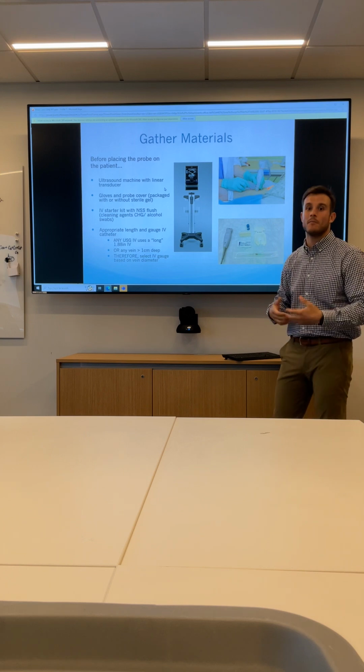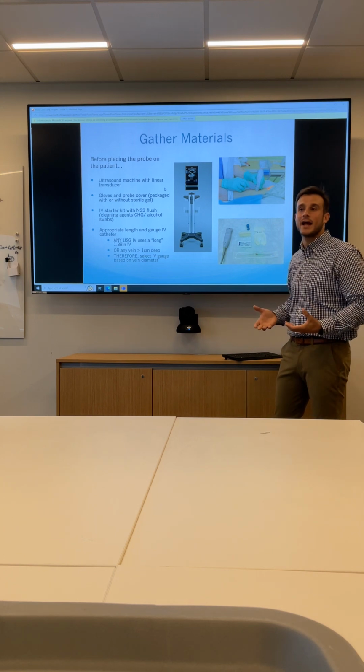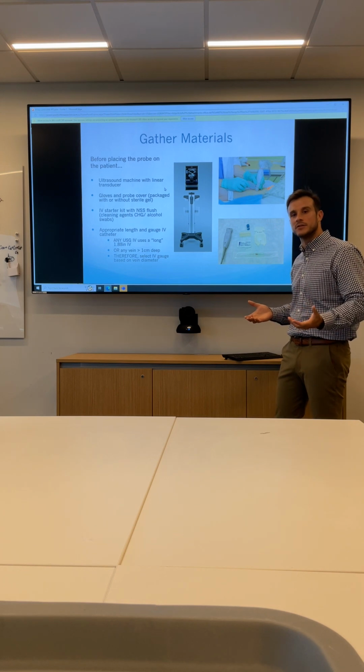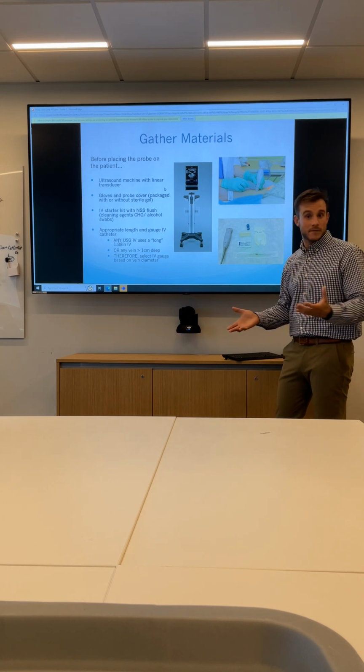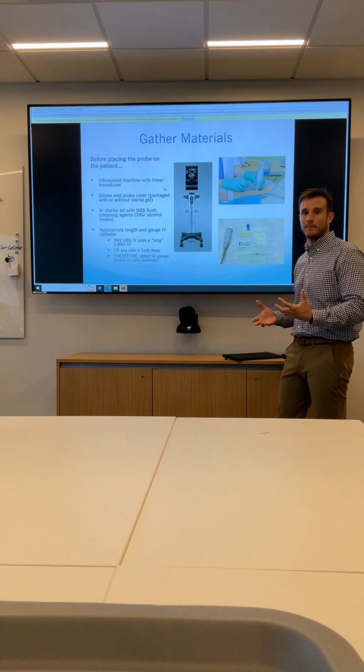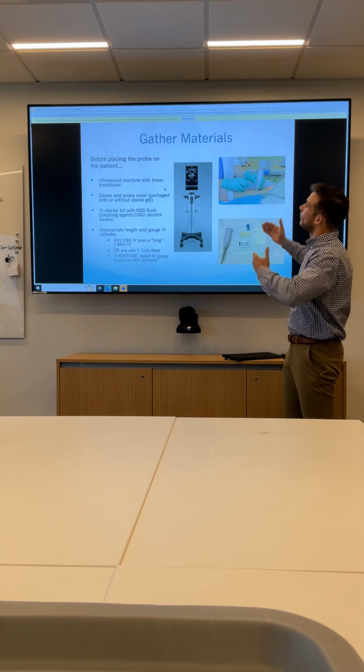and Mrs. So-and-so, my name is Mike, I'm going to be your nurse today. I understand that you require some IV access, and I'm going to attempt that with an ultrasound. Do I have your consent? Ask if they're okay, establish that trust right off the bat, and then we're going to gather our materials.